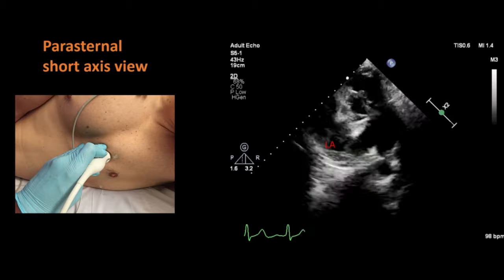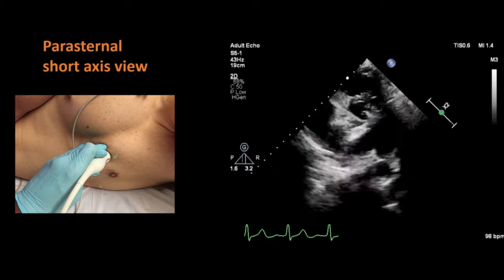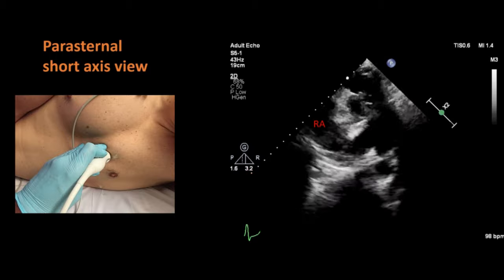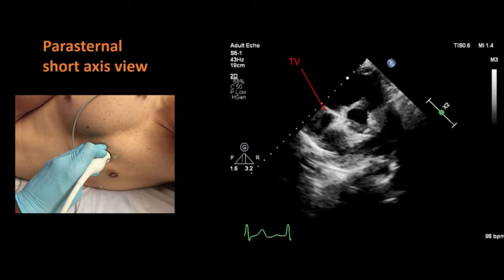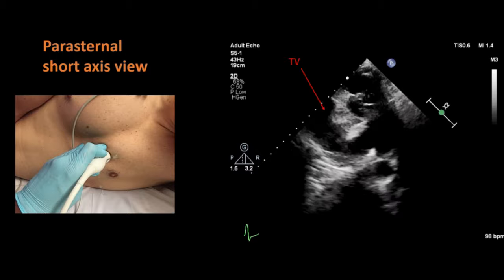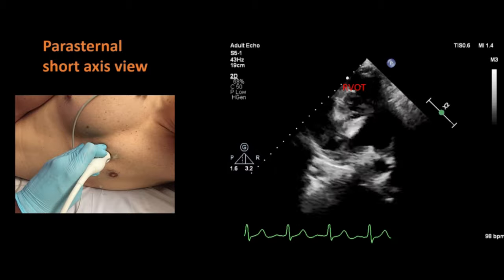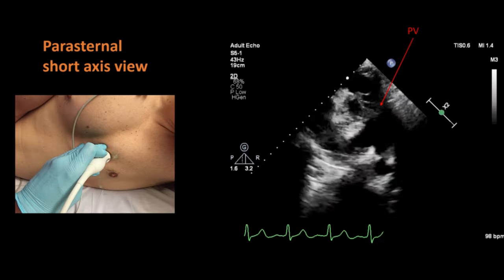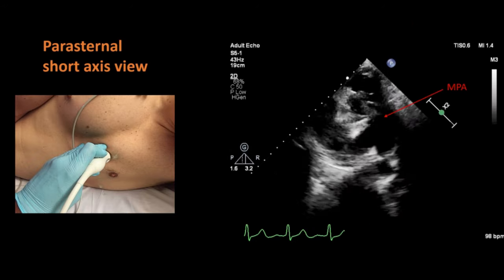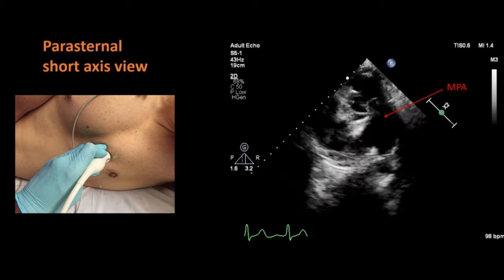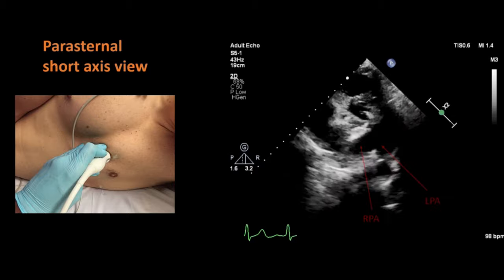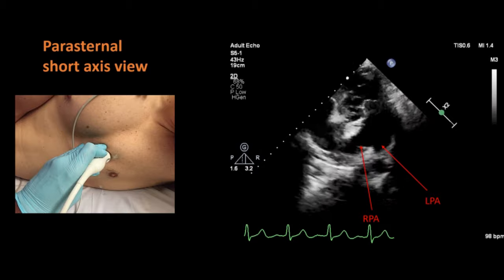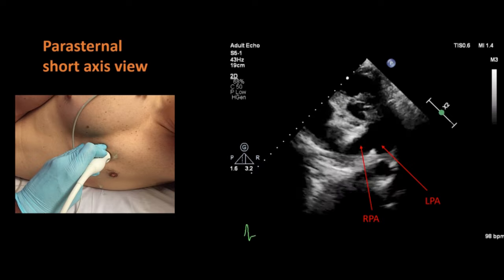In this short axis view at the aortic valve level, we can see the left atrium, interatrial septum, right atrium, tricuspid valve, right ventricular outflow tract, pulmonary valve, and the main pulmonary artery. By tilting the probe a little bit, you can see the main pulmonary artery dividing into the right and left pulmonary arteries.